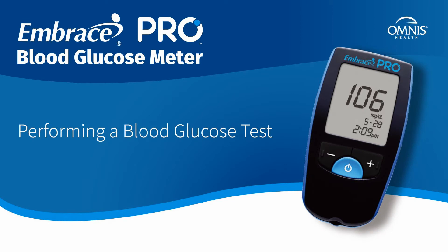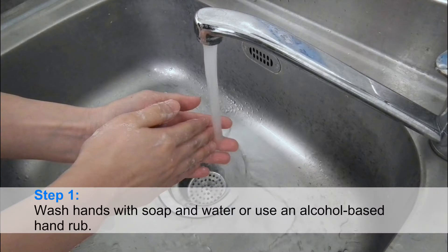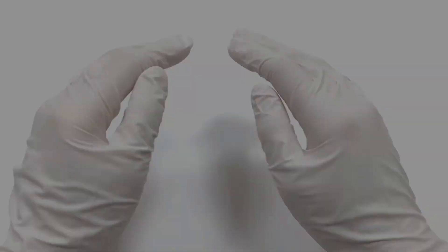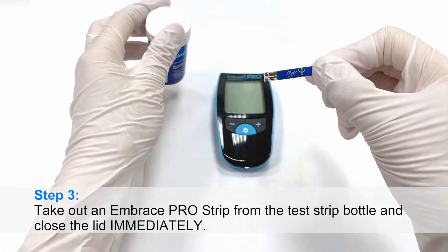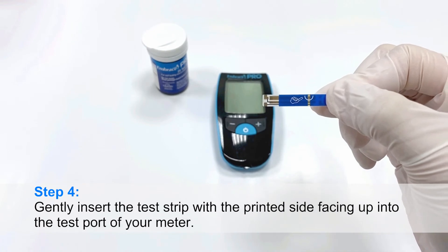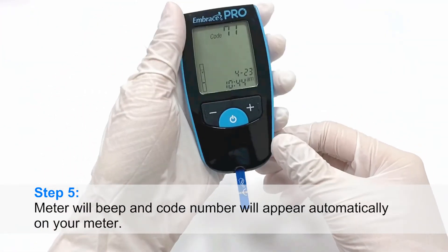Performing a blood glucose test. Step 1: Wash hands with soap and water or use an alcohol-based hand rub. Step 2: Put on a new pair of gloves and follow standard precautions. Step 3: Take out an EmbracePro Strip from the test strip bottle and close the lid immediately. Step 4: Gently insert the test strip with the printed side facing up into the test port of your meter.